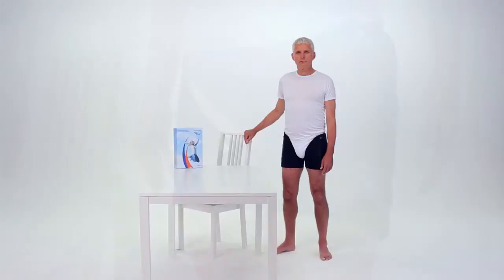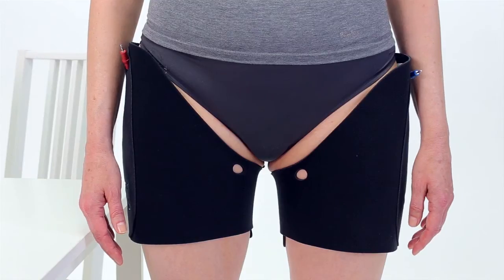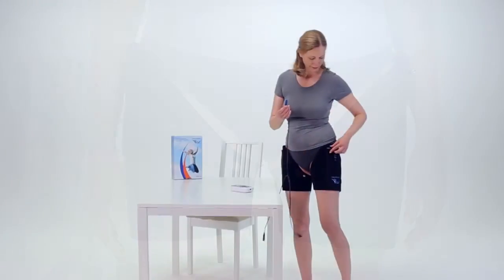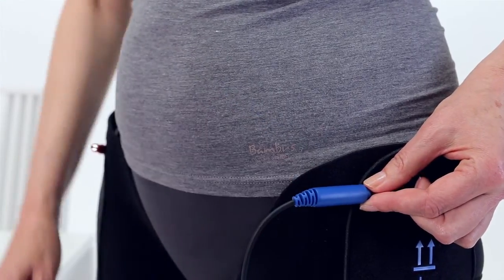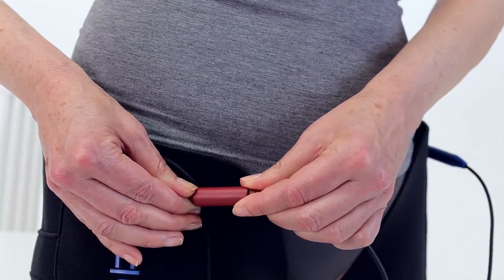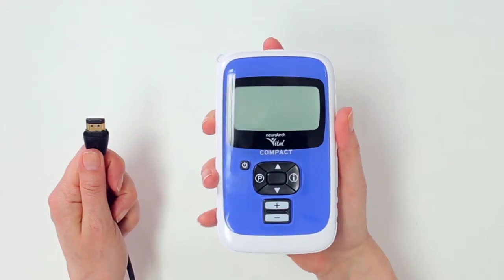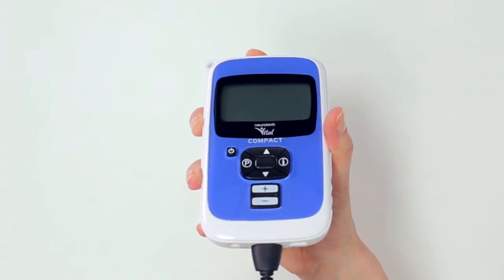The treatment is suitable for both men and women. Once you have both garments on, connect the blue end of the lead to the blue pin on the left garment, and the red end of the lead to the red pin on the right garment. Then connect the lead to the controller by inserting the main lead connector into the socket on the controller.